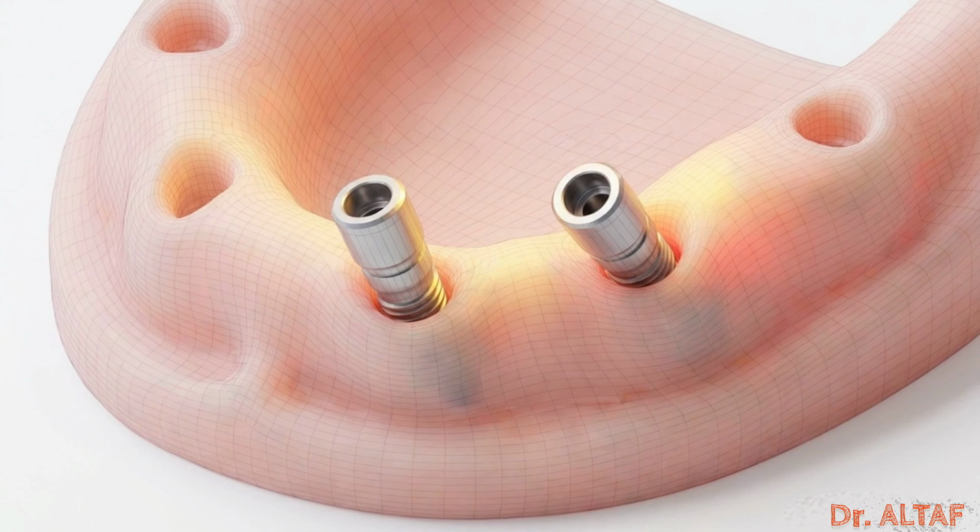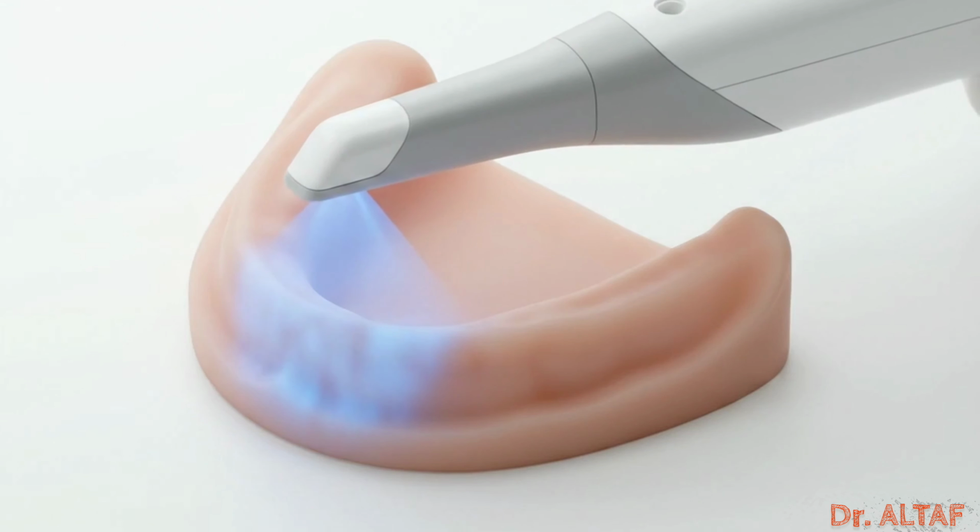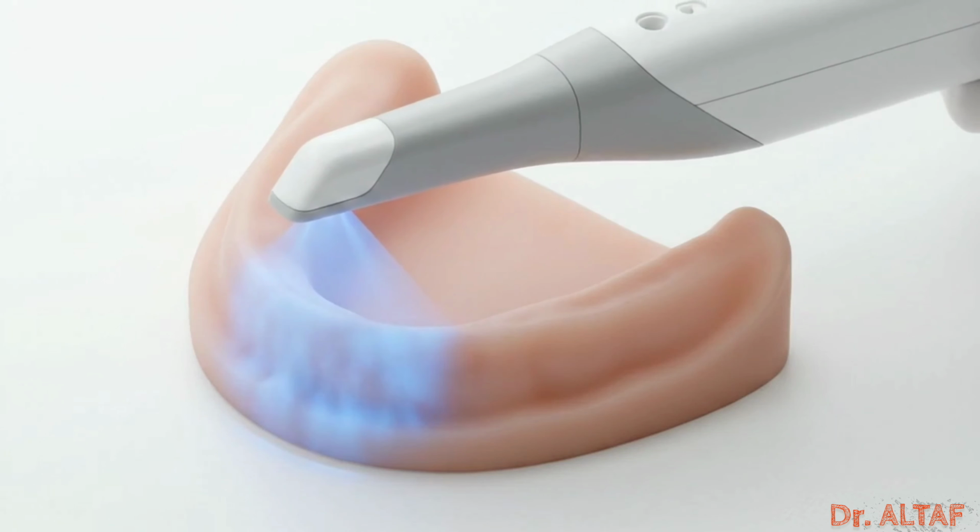When clinicians push standard intraoral scanners to capture an entire jaw, the technology routinely fails to provide that required passive fit. This failure rate is not the result of poor clinical technique. It is a mathematical breakdown in the mechanics of optics.